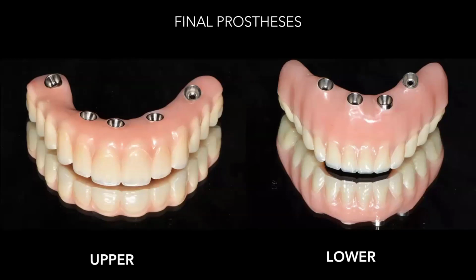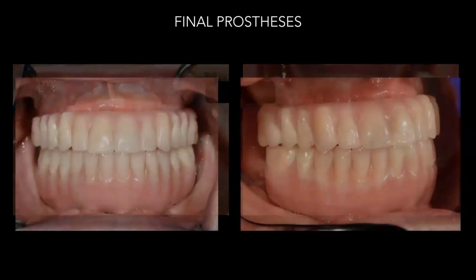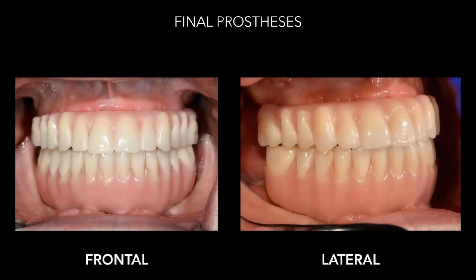And by designing the surgery, planning the surgery from the very first CBCT, understanding bone levels, understanding tissue levels, it really does help you provide a restoration or therapy that's going to be predictable and healthy. So there they go in. You can tell this case is really old because all of the acrylic is classic acrylic with classic denture teeth. We stopped doing that about 4 years ago, and everything from there has been milled by a milling machine, much stronger, much more hypoallergenic, and much more stable. But good looking restoration. She's super duper happy.